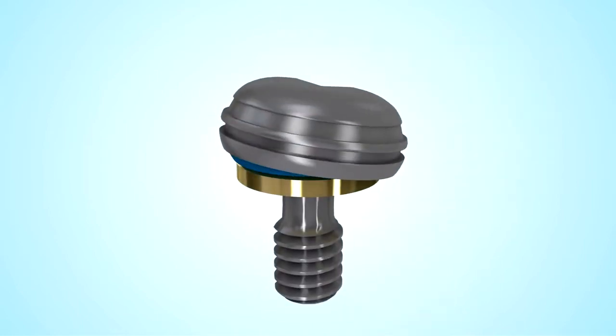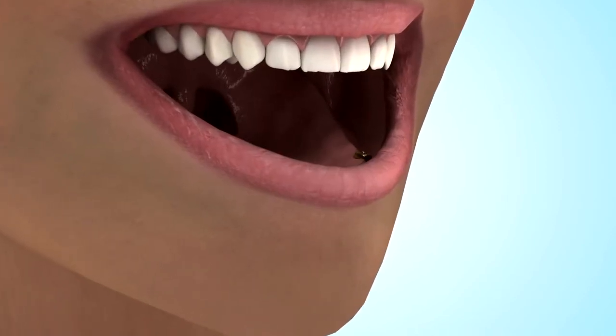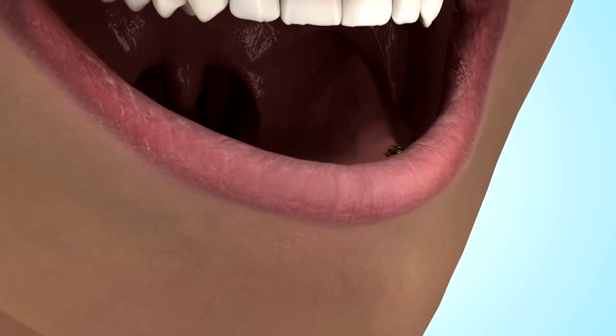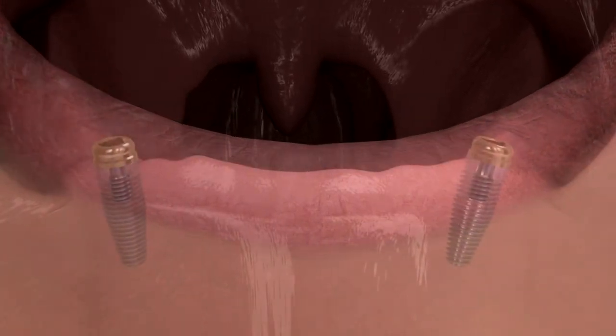Zest's Locator attachment features a unique, patented pivoting technology. The Locator's innovative ability to pivot increases the attachment's resiliency and tolerance for the high mastication forces an attachment must withstand and allows it to compensate for the path of insertion, even with up to 40 degrees of divergence between implants.